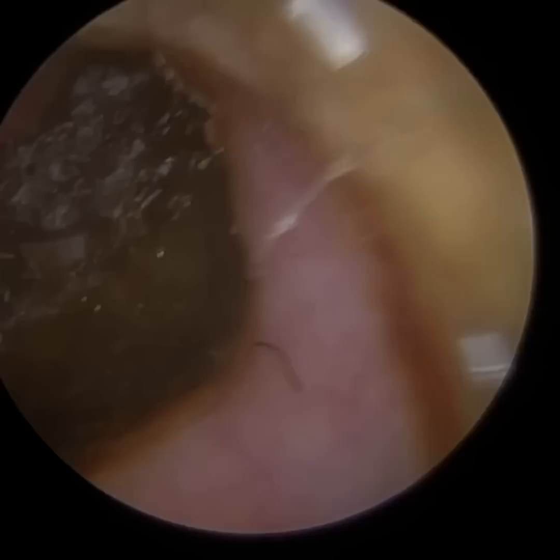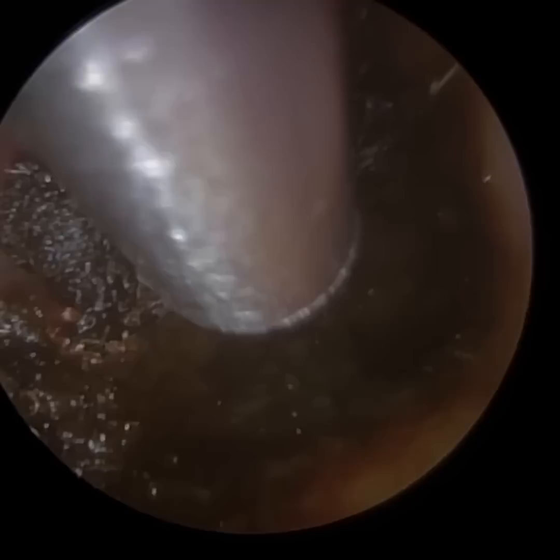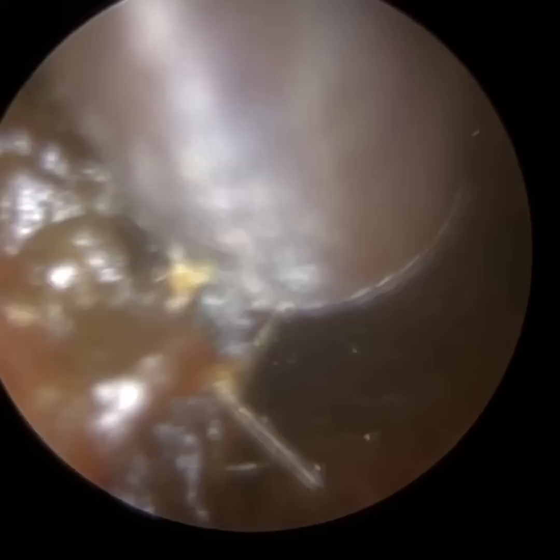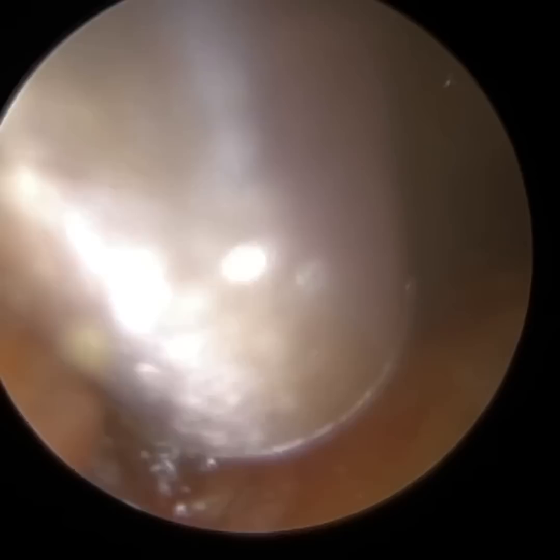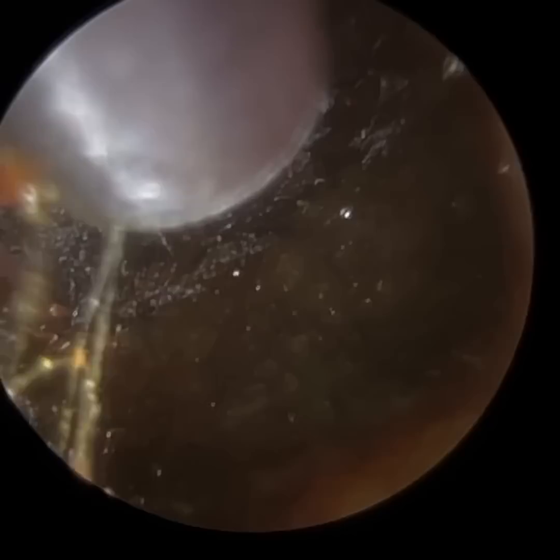It's the same patient here, we're just doing their right ear. I think I just put some drops on this side because it looked a bit drier. And I'm just looking for the weak spot — if I try and peel it from here, so this is probably mid-canal, and if I just detach this from the eardrum, sometimes it can just help peel it all the way off the eardrum as well. We're just at the bottom of the ear canal. But it was a bit sticky, so I'm just going to go to the core now to see if I can loosen and break this up.